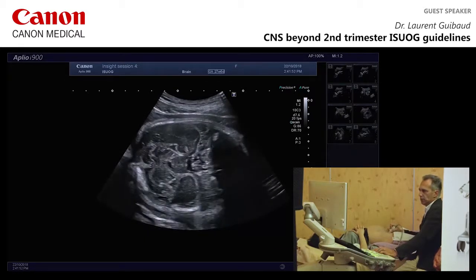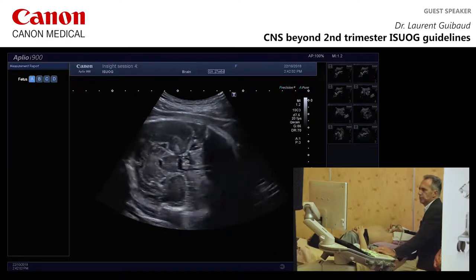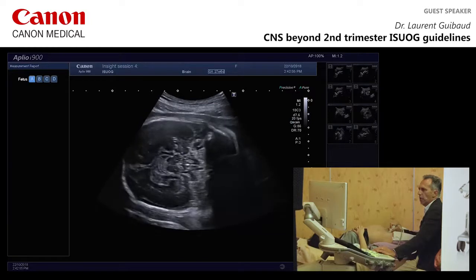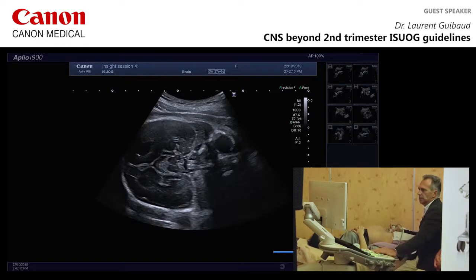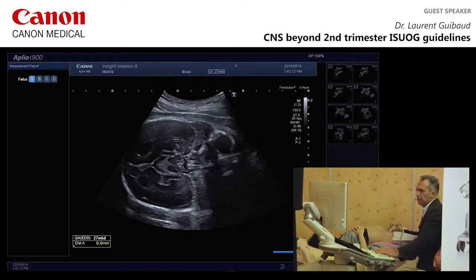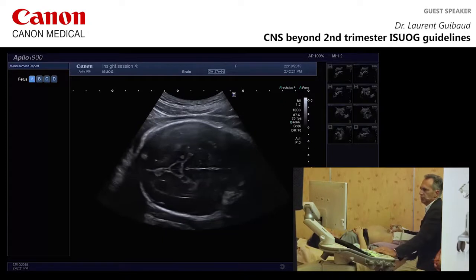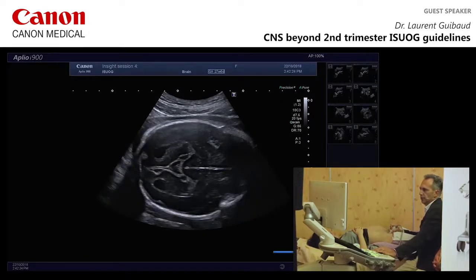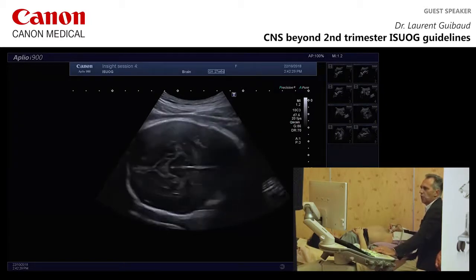No question about the optic nerve? I know people want to see the optic nerve. In that case, you see clearly the two optic nerves here, depending on how important the peripheral spaces are. In that case, it's very easy to see the optic nerve coming from the chiasma, which is here, and the two optic nerves here. Okay? Perfect. She's a nice patient. Yeah. Keep in mind this V shape. Try to always have this V shape.